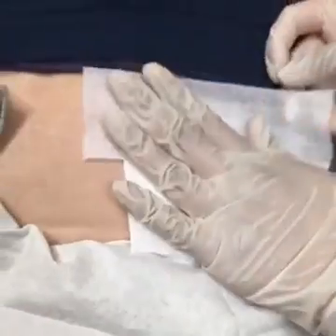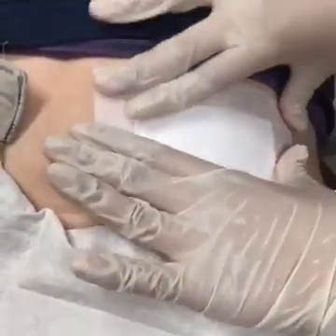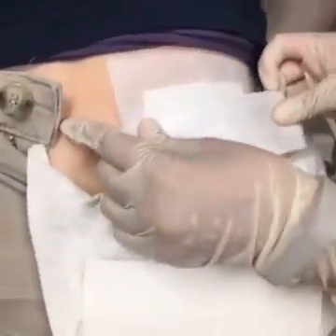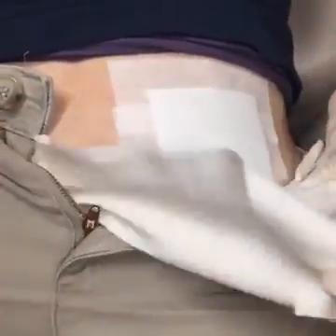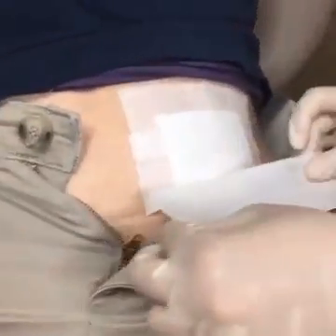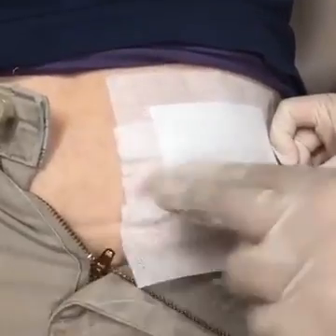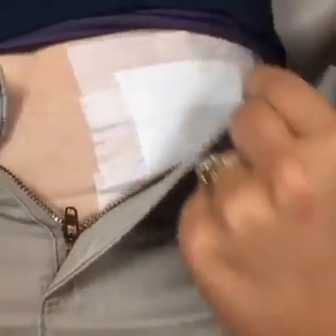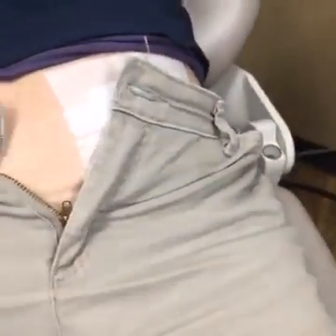Thank you. So now they're covering it with Vaseline and putting a bandage on it. We would ask that she keeps it bandaged for the next 24 hours, and then after that keeps it greasy with Vaseline and doesn't get any sun and tan. And we will be posting some before and after pictures for you guys. And we will definitely post what her tattoo looks like in a month.